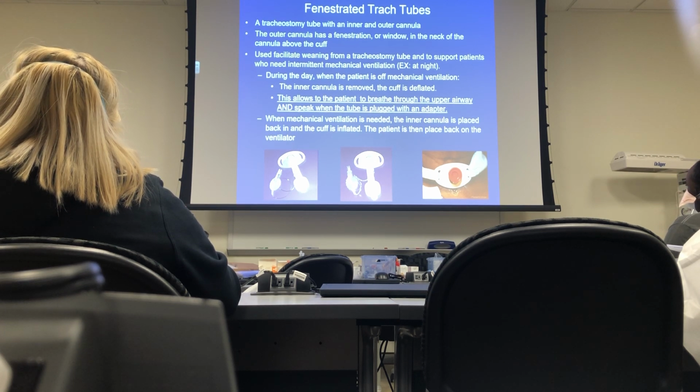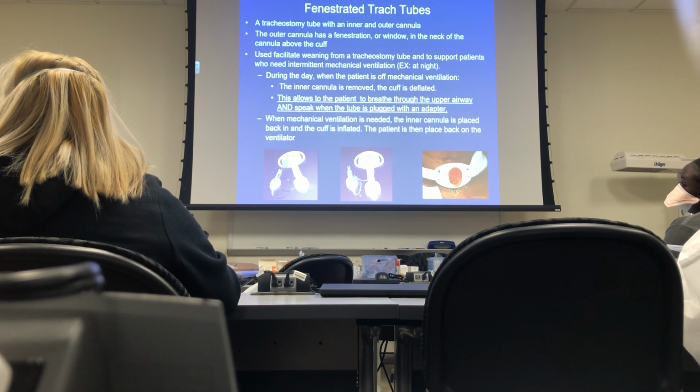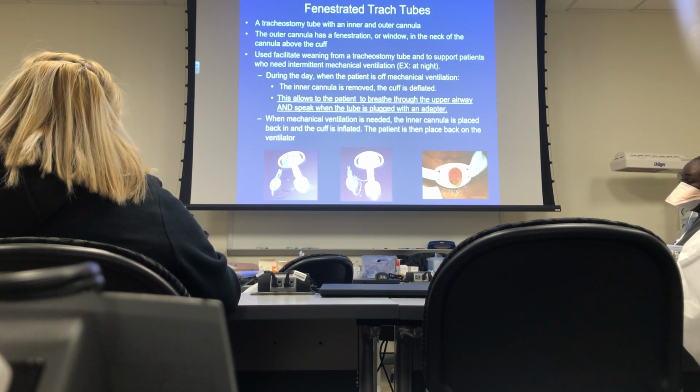So again, what do you do first? Suctioning. If you put the button on and then deflate the cuff afterwards, oh boy, that's going to be wrong. Suction, deflate the cuff, button on. With that button on, what are they using, guys? Upper airway. They're using their nose and their mouth to breathe.